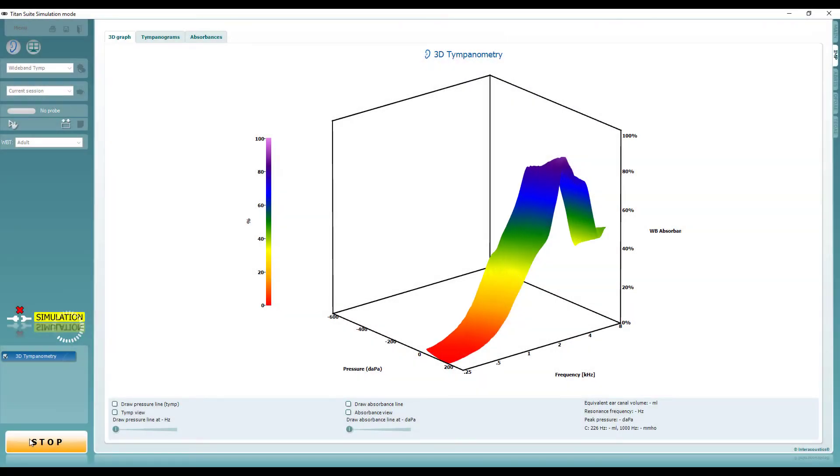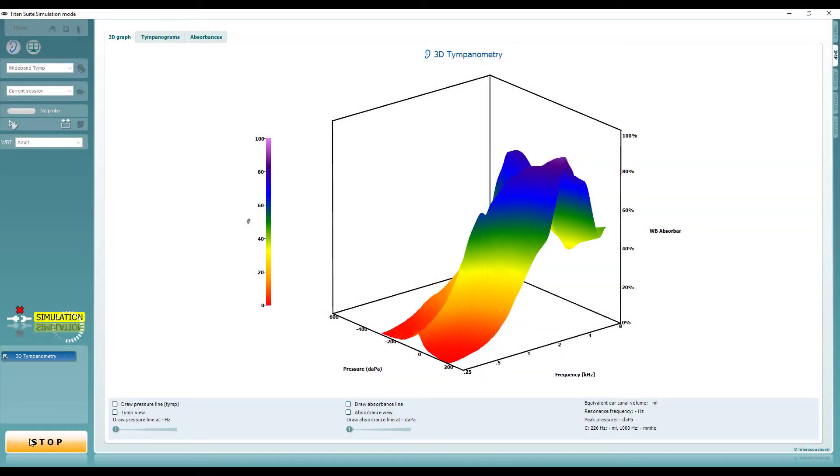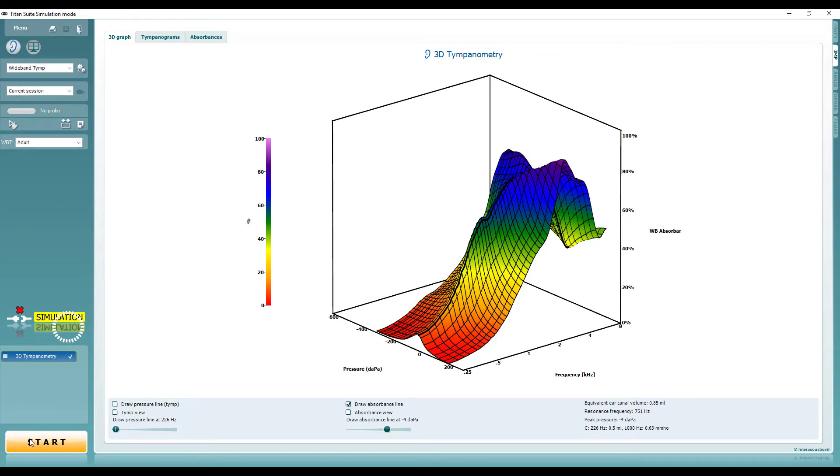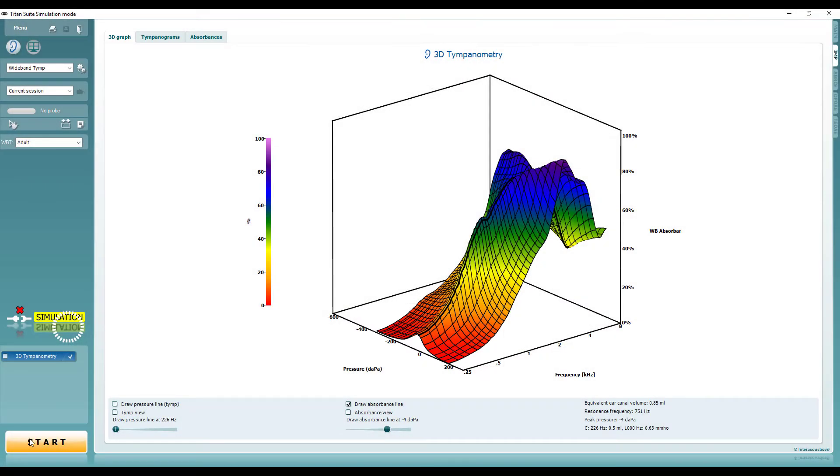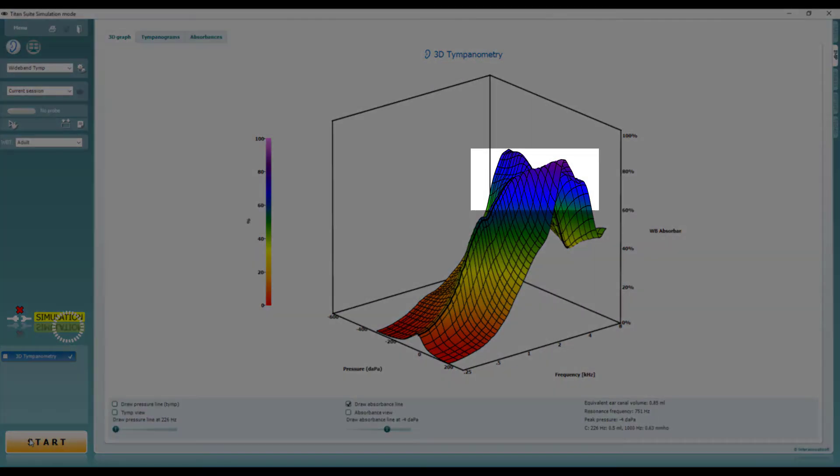The first data graph you will encounter is the 3D tympanogram. Experienced testers will be used to visualizing this display and noting whether there are any gross abnormalities. The color range provides an instant overview regarding absorbances. Low absorbances are expected in the lower frequencies with higher absorbances typical for the mid to high frequencies.